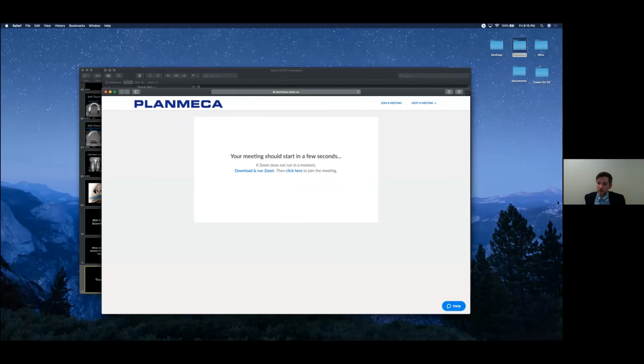So, cone beam, the dose varies widely, but I think you'll find that there are many options to suit your needs, whether it be low dose small field of view or high dose, to find really minute fractures. There's a large dose range. So for your diagnostic task, you should be able to adjust those factors accordingly.